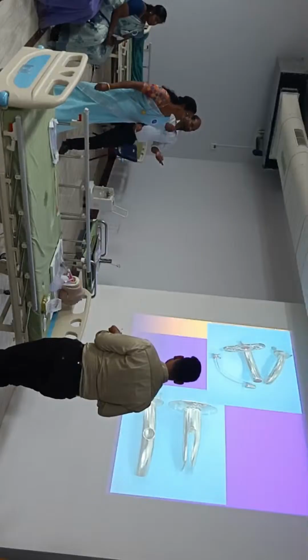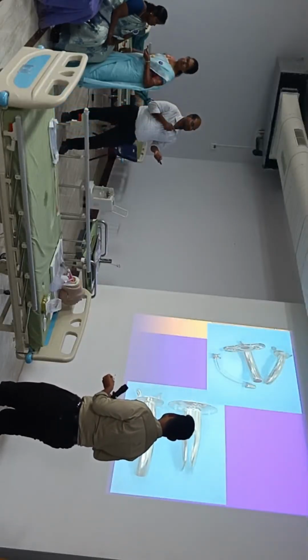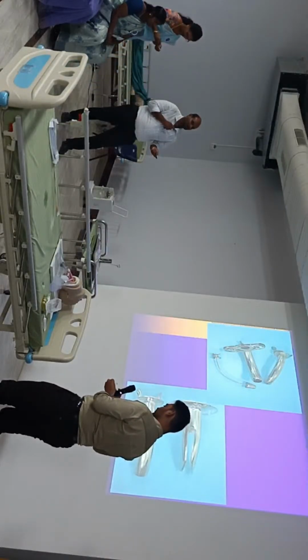So you can see the tube has three parts. This is a Jackson's tube. The tube has three parts: the outer tube, the inner tube, and this is a trocar. Can you see three parts there?